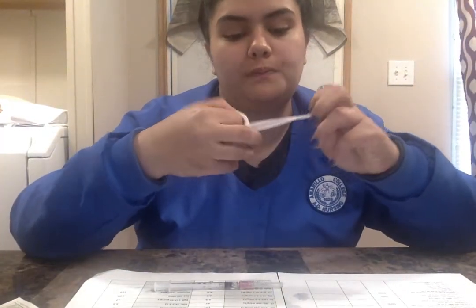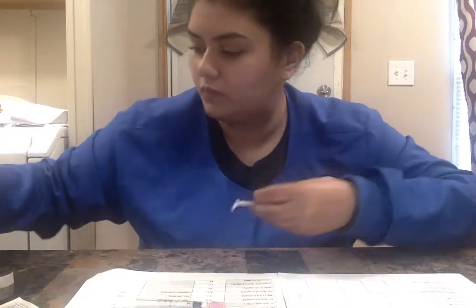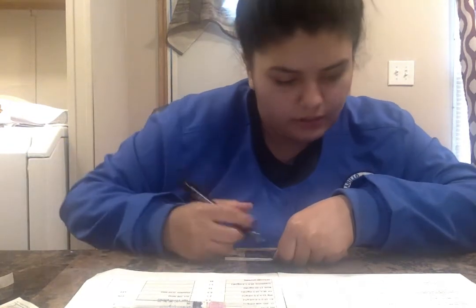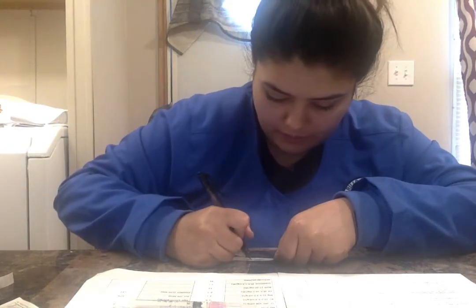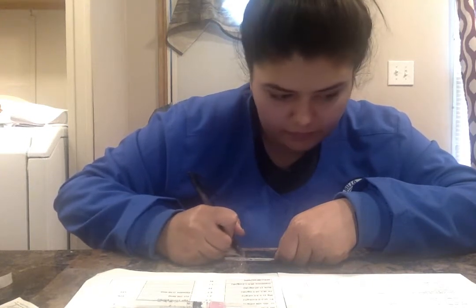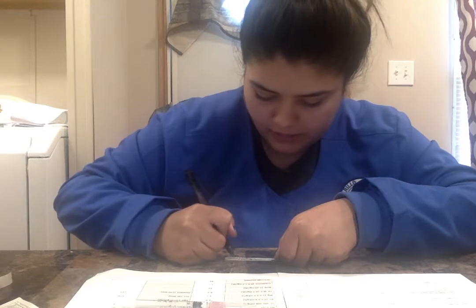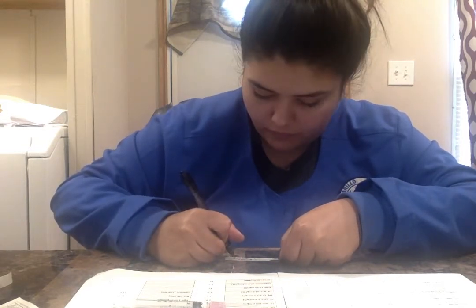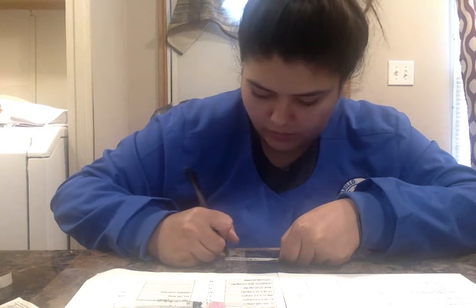And this is going to be labeled. So we're going to label this right now. So this is TB PPD 5 TU ID, slash 0.1 mL.